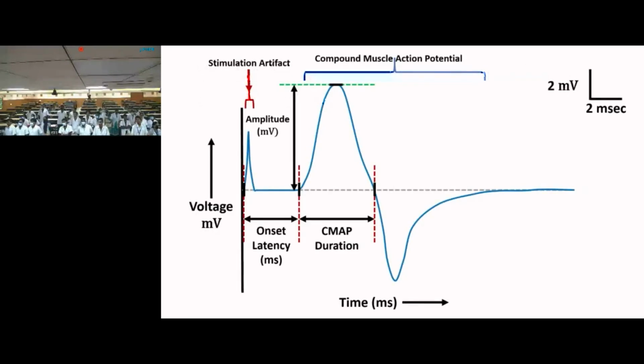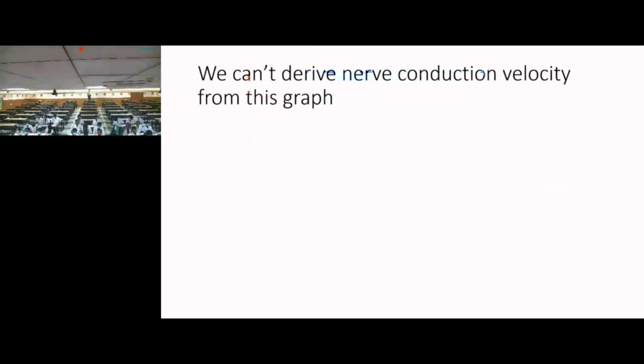And from your peak to the baseline is going to be your amplitude. So from this, again, you have to concentrate on your onset latency. Right, from the same thing, we know the distance now. We know the onset latency also.